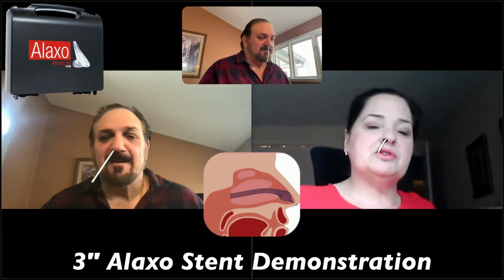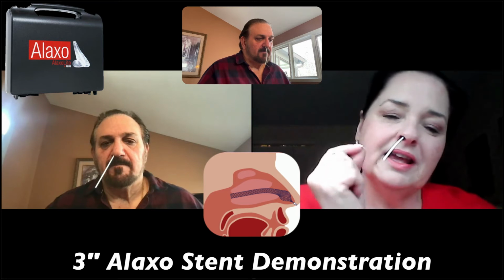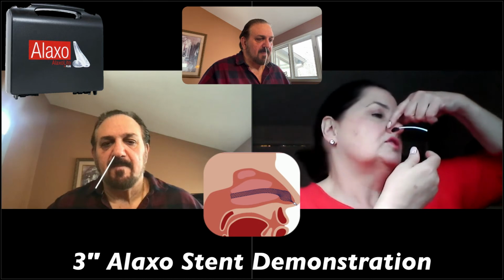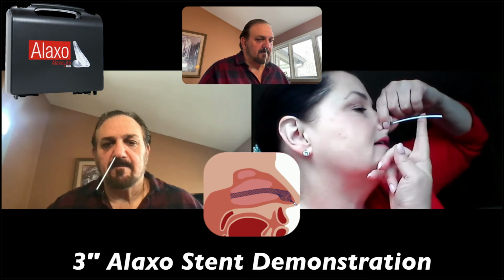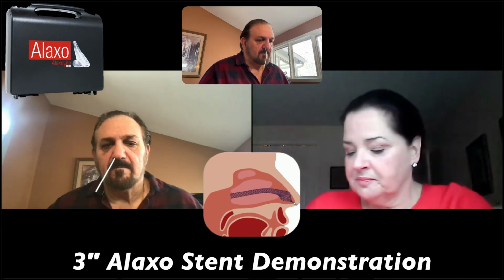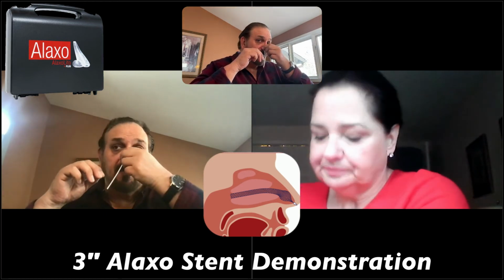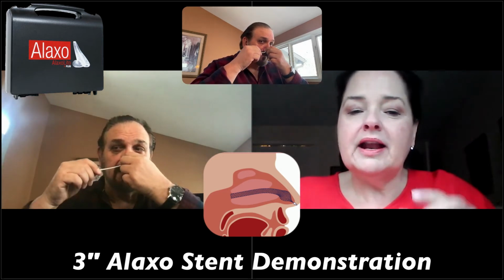So now what we tell people to do to get this little piece off, because sometimes people do have trouble with this, because it's new and a little stiff, so it's hard to snap off, is you can pinch your nose here where the silver ball is. Take the pusher rod and bend it right towards your cheek to snap it off the end. I actually have mine out too far. Okay. Kind of pinch it and then, yeah, that's uncomfortable, right?